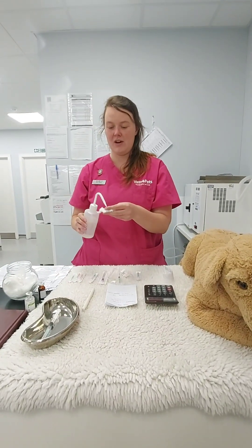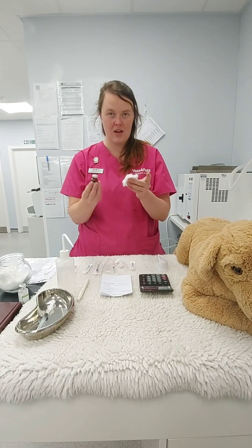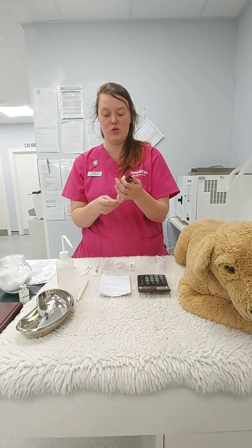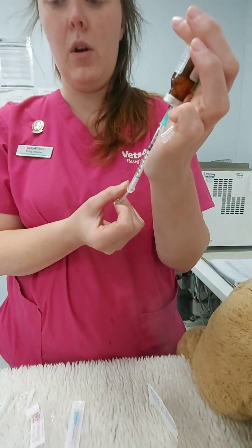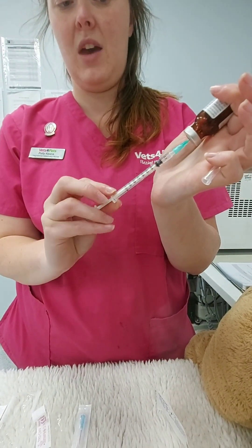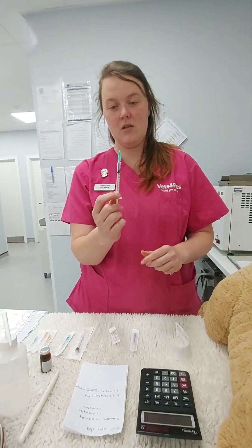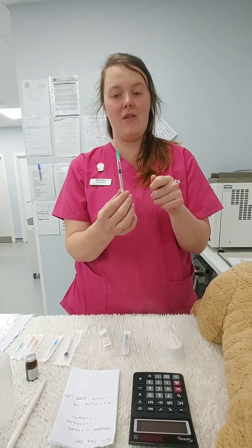We have to do our spirit swab first — a bit of spirit on cotton wool to clean the bottle off. We would put that away in clinical waste. Take our needle and syringe — there's no liquid here because it's an expired bottle, but you will have liquid in the exam. Pop in and draw up as appropriate. Draw up slightly past and draw back again so you have the medicine in there, then draw up to 0.1 ml. Don't touch the needle; pull it down. You can use either the lid of the sharps bin or a pair of artery forceps.